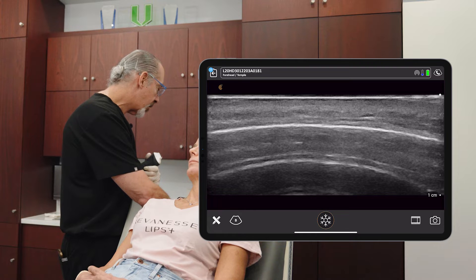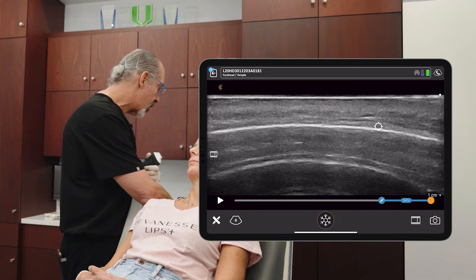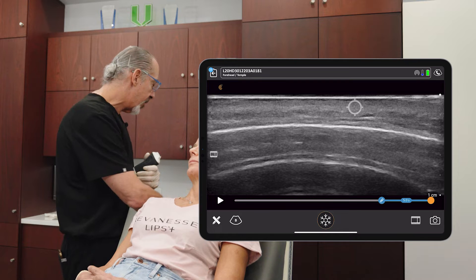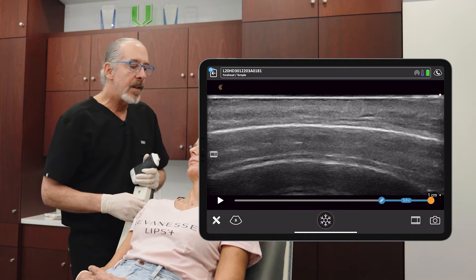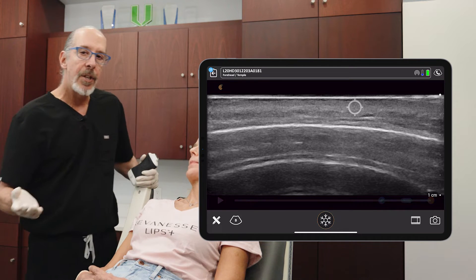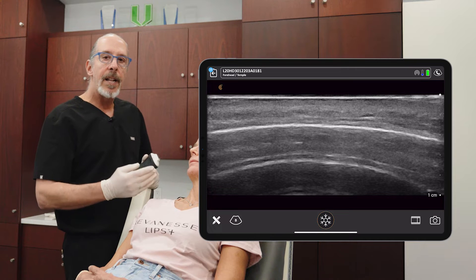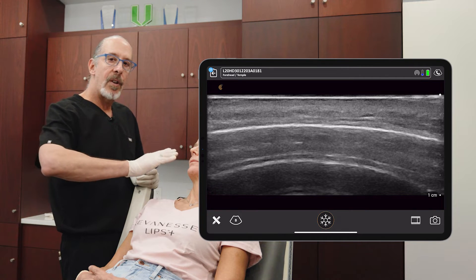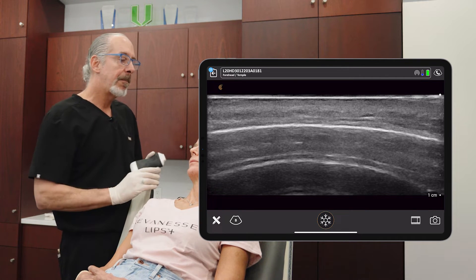Below the muscle is going to be a fat pad, and superficial to the muscle is also going to be a fat pad. Keep in mind that as you go more superior in the forehead, the muscle becomes closer and closer to the bone and gets a little deeper.